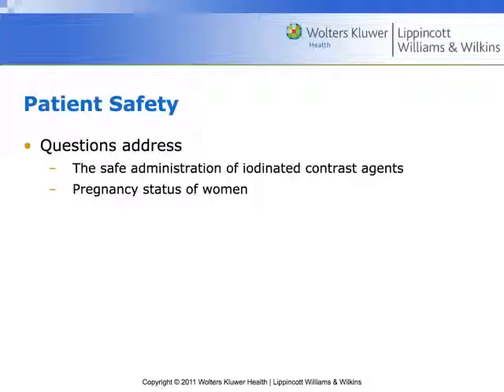Where's the contrast? I go and I check the IV, it's fine, the IV is fine, it's all up here. She has 100 milliliters of contrast in her shoulder. How did that happen, right? She kinked the vein up here. She brought her arm up, and she kinked the vein, right? Blew out the vein up here. All the contrast is up here. Honestly, I don't know if she was ever able to use that shoulder again, right?